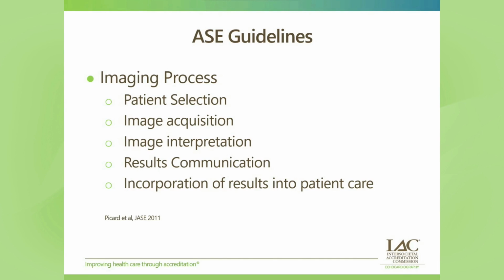Image acquisition in echocardiography relies on a variety of components, including but not limited to patient conditions, equipment, competency and technical manipulation of the ultrasound system, and consistent methods of acquisition. Echocardiography image interpretation must include assessment of all cardiac structures, function, and performance of all measurements when technically feasible. The interpretation should also include a summary of the findings relative to the indication for the examination.